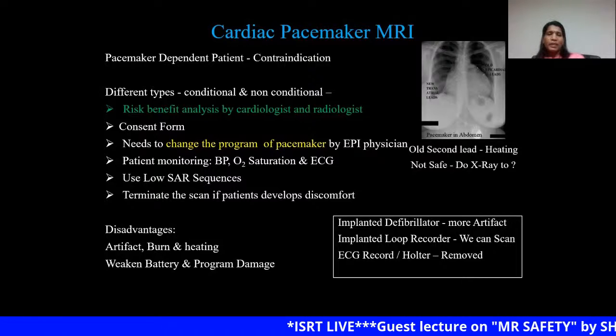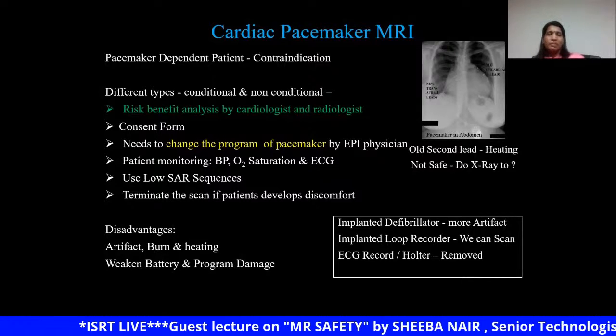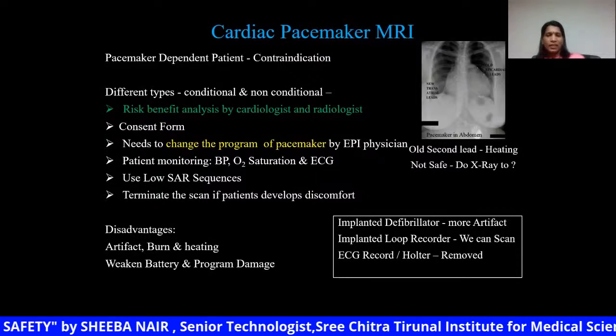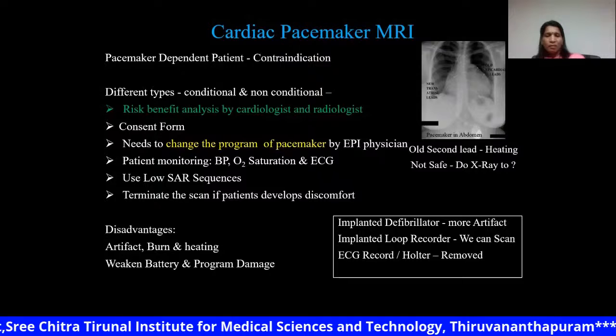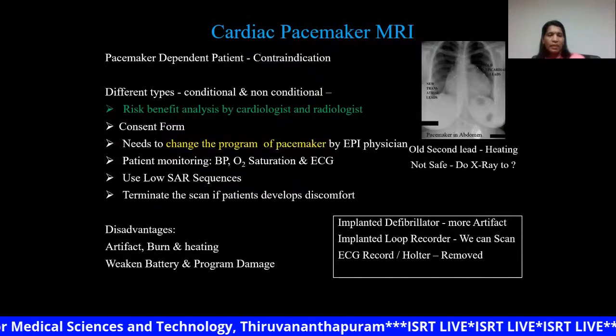So for all patients coming for MRI with a pacemaker, there should always be a risk-benefit analysis made between the cardiologist and the radiologist, and the patient should be well informed about the possible risks and the benefit he or she is going to get from the MRI.